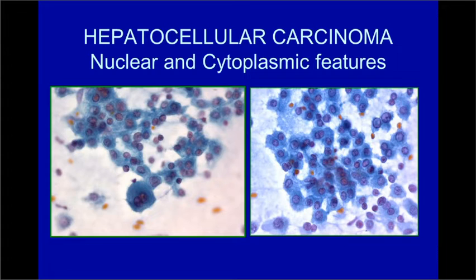cells become more uniform, and they develop an increased nuclear cytoplasmic ratio, as we see here. They still retain that granular cytoplasm that's well-defined and polygonal, but the N:C ratio is altered, and then these cells have this very monotonous appearance. Notice how similar they are in appearance, and also over here. And notice that we have fewer bi- or multinucleated cells, although we can certainly see them in hepatocellular carcinoma. And sometimes we even get nuclear pseudo-inclusions in hepatocellular carcinoma, as we do with hepatocytes with degeneration. And here are a few other subtle nuclear atypia, including some grooves.